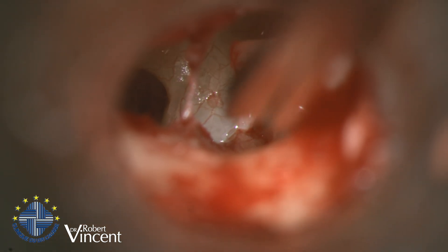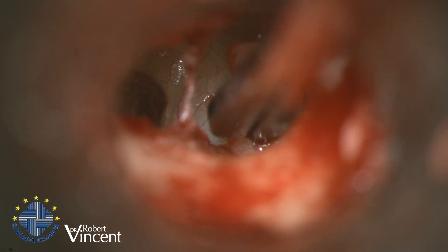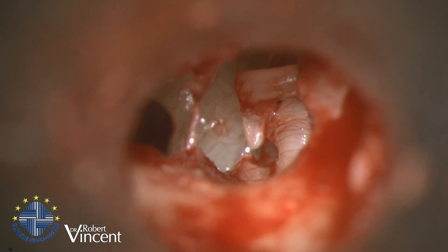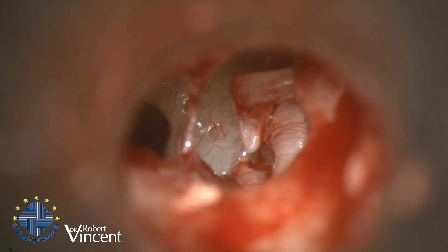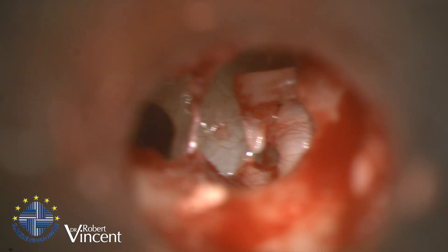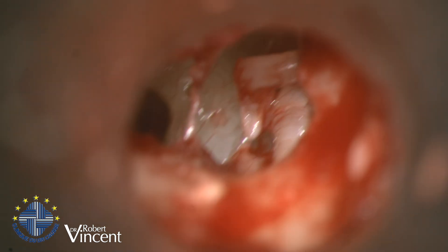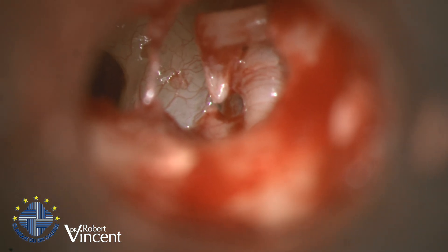First I will cut the stapes tendon. The exposure of the posterior crus is not so bad.